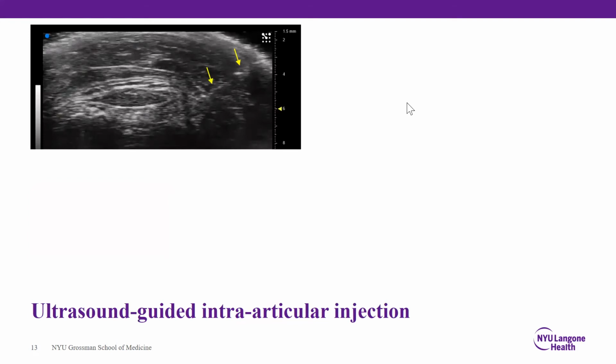Specifically for our study, we use a 1.5-inch needle attached to a Hamilton syringe because we ensure the precise volume. And then we constantly monitor the plane of the needle because it shows like a specular reflector. You can see here the arrows marking the needle.